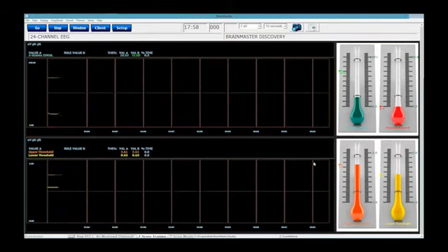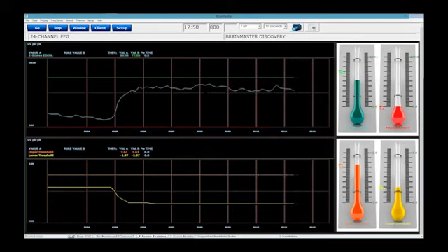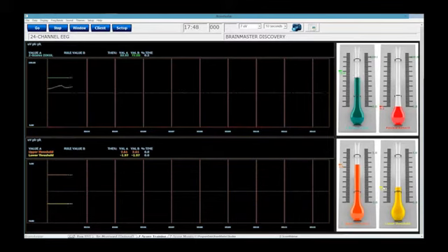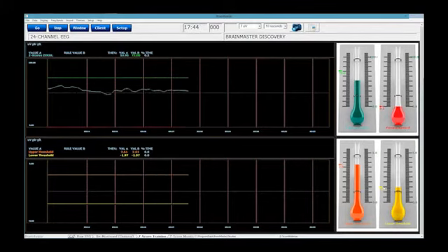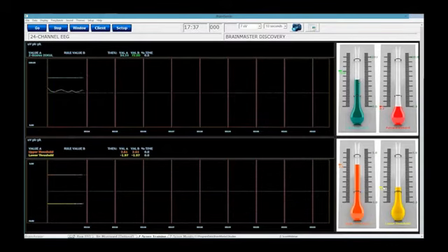Is that going to be really relevant for you? It might not be, but that's where it really comes in. The two thresholds give you a little more flexibility to control where you want to look at your bottom and where you want to look at your top. Maybe you have a whole lot of higher Z-scores, but you don't want to focus on a lot of the lower ones. Well, you've got that kind of play that you can do with it. So that's really the only difference between them.